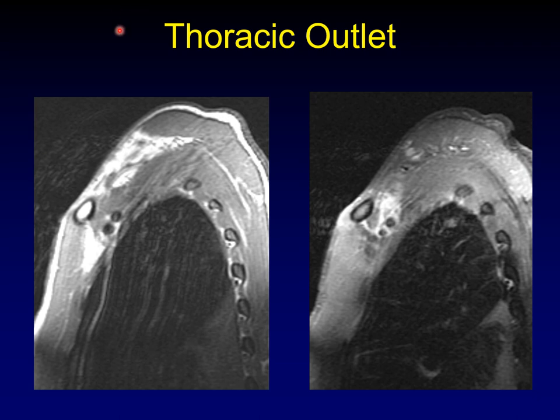One more hematoma example to emphasize the thoracic outlet concept. Here is the clavicle and the first rib — the gap between them is the thoracic outlet, through which arteries, nerves, and everything must pass. Slamming the clavicle back into the first rib causes a hematoma in this narrow space. On post-contrast imaging there may even be surrounding enhancement, and all the brachial plexus divisions that should appear as discrete round dots are mixed up into the hematoma. Thankfully, this will improve with time.